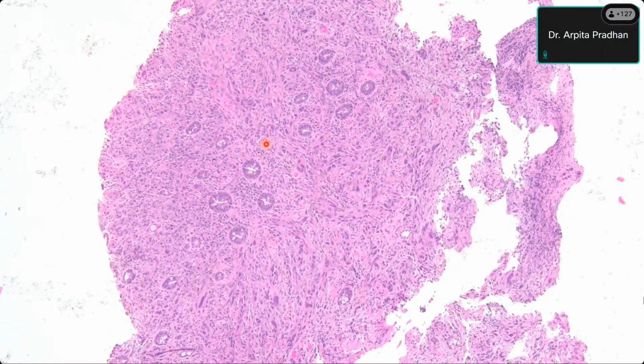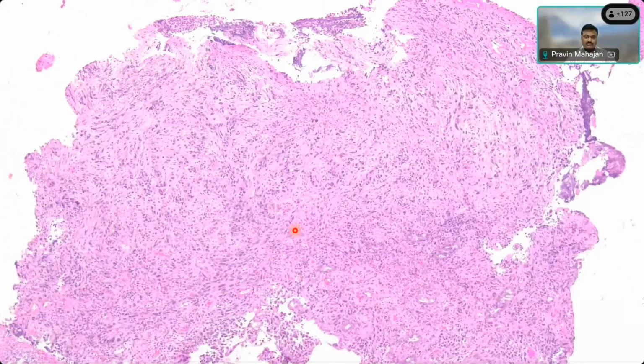Correct. Now another area. What is this area showing? We can see that the infiltrative pattern is retained. So there is a tumor which is infiltrating, right? With these small clusters, different types of clusters of cells, or maybe even fascicles like this. So it's invading the mucosa, right? Yes, sir, and some mucosa. This could even be a part of submucosa also.